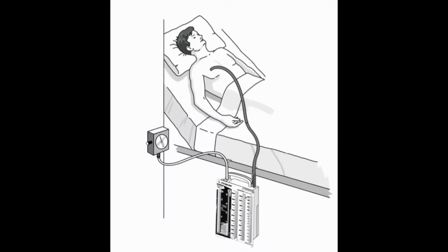It'll either be post-surgery in a smaller hospital that then may need a patient to be transferred to a larger tertiary hospital. And it's also used when there's a collection of fluid, blood, and air in the pleural space post tension pneumothorax or a hemothorax. And it assists in the draining and collection of this fluid and restores gas exchange.